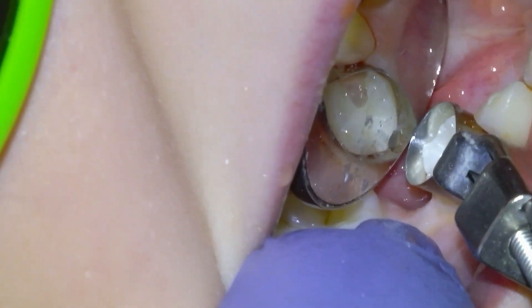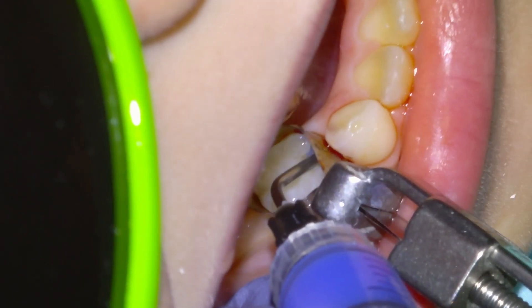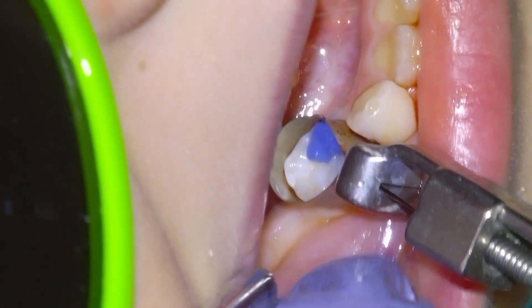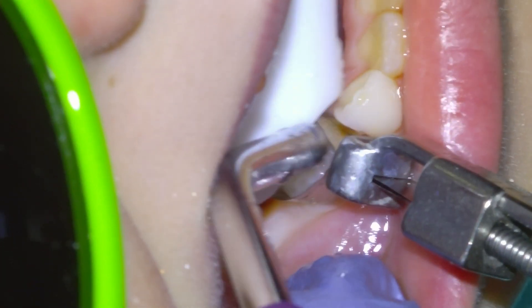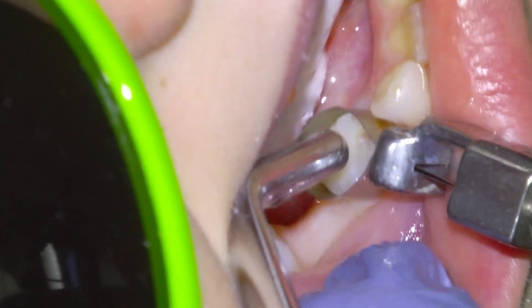We're going to restore the tooth with Fuji 2 LC material. We'll etch the tooth for five seconds, rinse thoroughly, and then mostly dry. Then we're going to apply our glass ionomer material. I always overfill the cavity with glass-based restorations and then ensure tight adaptation by compacting the material with a moist cotton pellet, then light cure the material to set it.